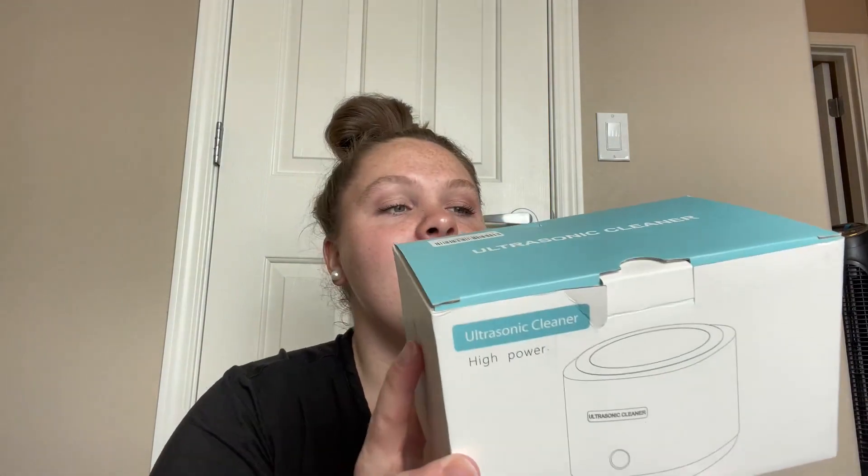Hi guys, my name is Emily and I wanted to hop on super quick to give my honest and unbiased review on this ultrasonic cleaner. You can use this for dentures, you can use it for retainers, and so I'm super excited to use this.